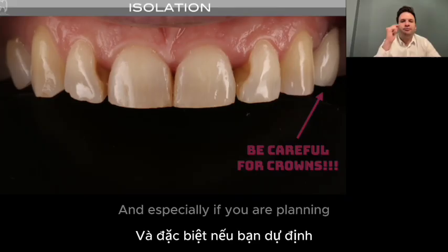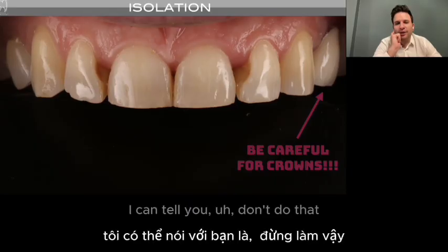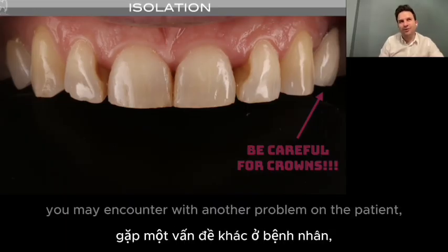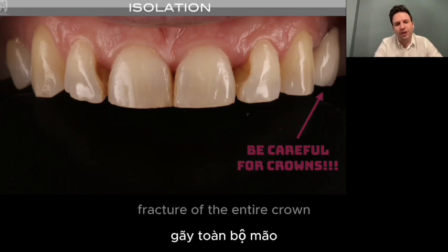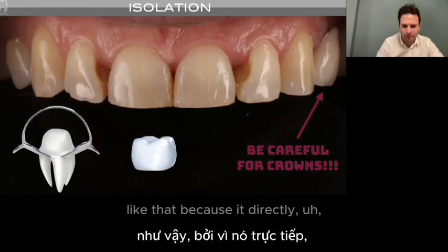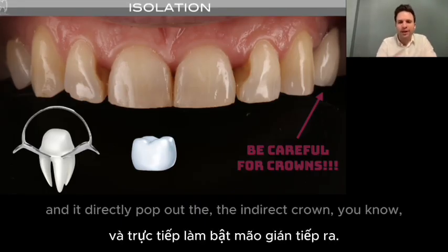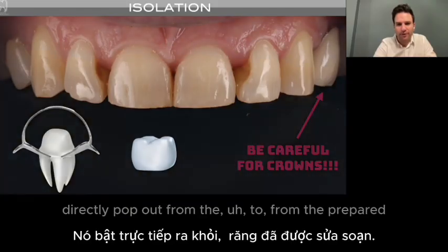And especially if you are planning to place a clamp on the dental crowns, I can tell you, don't do that, because you may encounter another problem with the patients, such as fracture of the entire crown or popping out the crown, because it directly makes pressure from the cervical area, and it directly pops out the indirect crown from the prepared tooth.